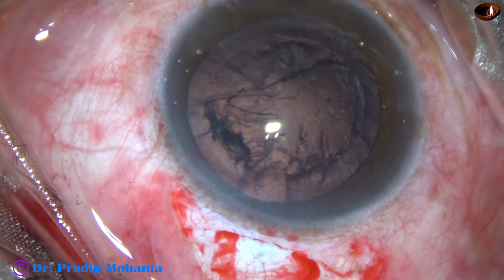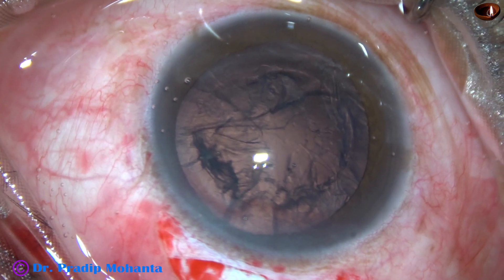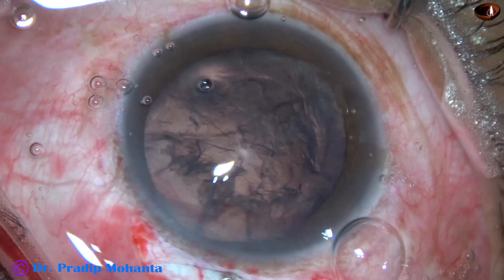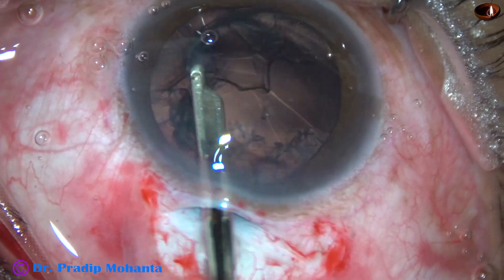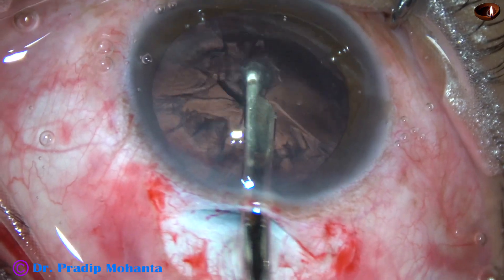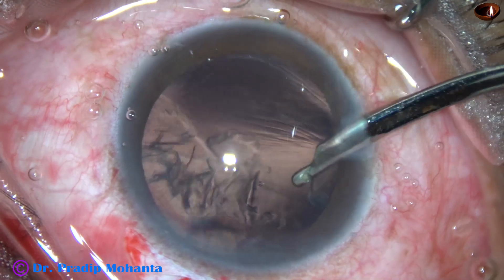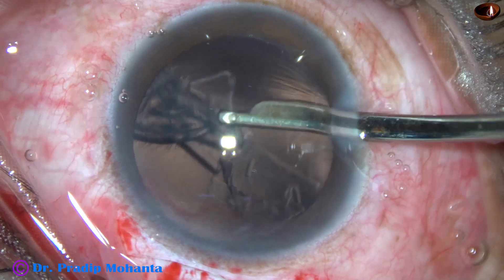Now we have to clean the cortex. Using the 23-gauge Simcoe, cleaning the cortex from the inferior part — from 10 o'clock to 4 o'clock. Going through the side port, the rest of the cortex is removed.